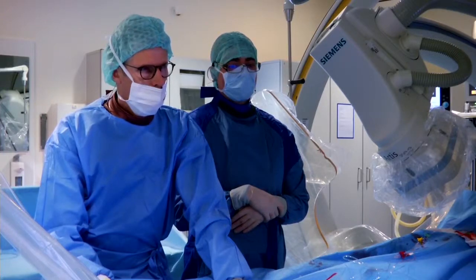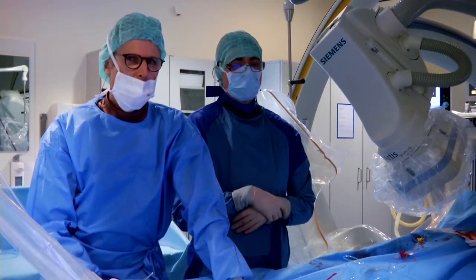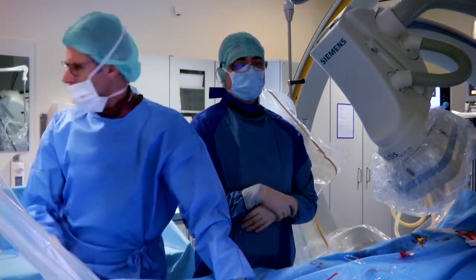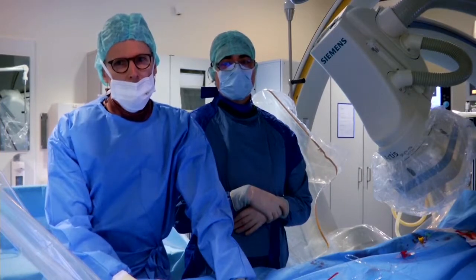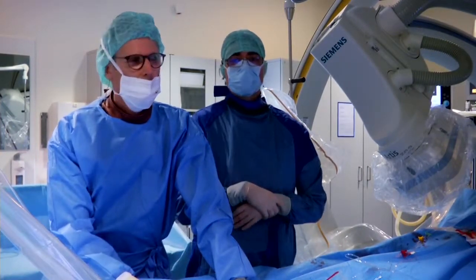Second question, what was your bailout strategy if you would have a severe aneurysm? We have the Bentley aortic in 12 millimeters, and I think, how long is it? 19 millimeters long. Yes. So we have it here on the table. So if really something happened, we have already the 9 French sheath and the Bentley aortic graft here in the lab.